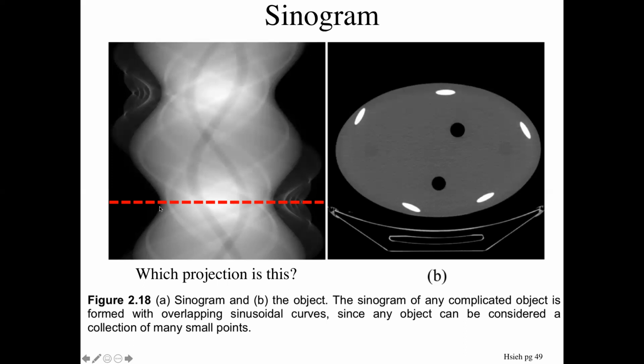Okay, the first thing to look at is the width of this signal, of the main signal here, right? That's the first thing. So this looks like it's a minimum width. So that means the dimension of the large object is minimum on this projection view. So that means it's either going this way, right? And our detector's here, because this dimension is minimized on this ellipse that way.